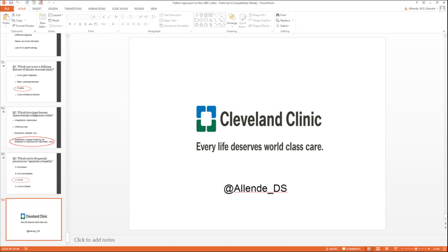That being said, in the case that I show you today of ischemia, I know the patient has ischemia, it's reparative. I will have a very high threshold to call that neoplastic. And many times what happens is every section looks the same. So it cannot be that every section is neoplastic, right? So it's another clue that maybe should make us pause and reconsider a regenerative change.